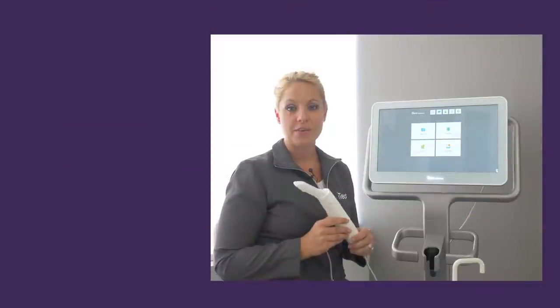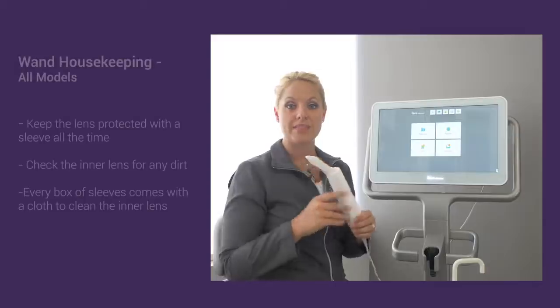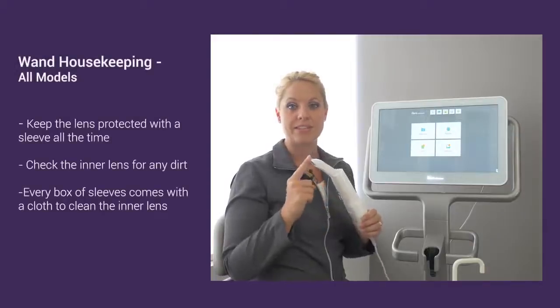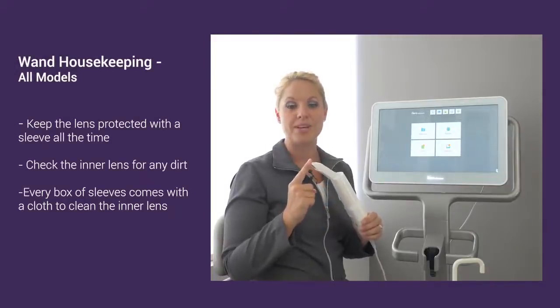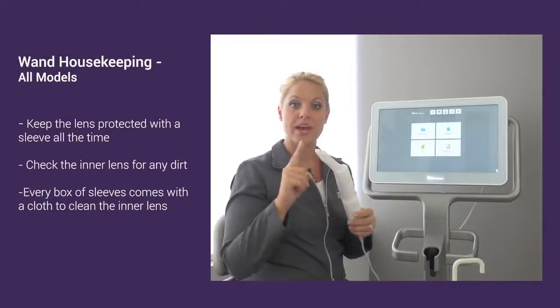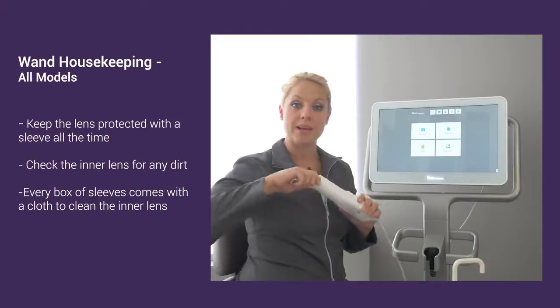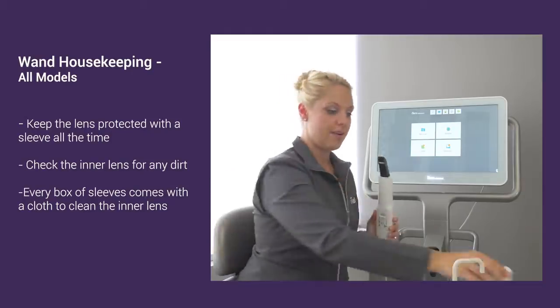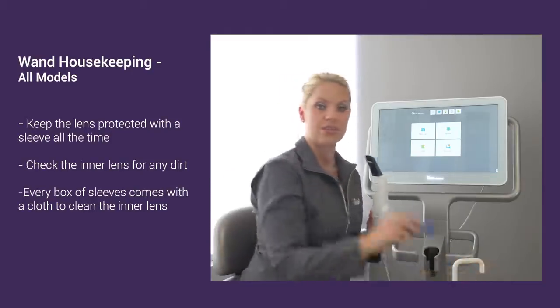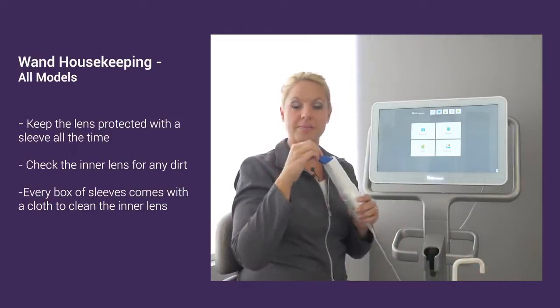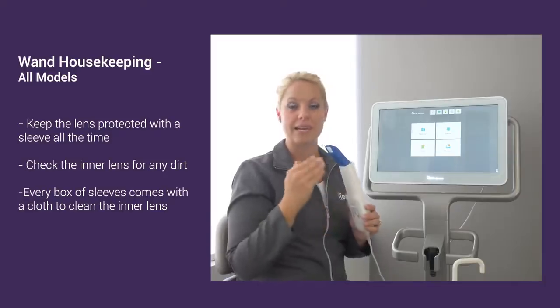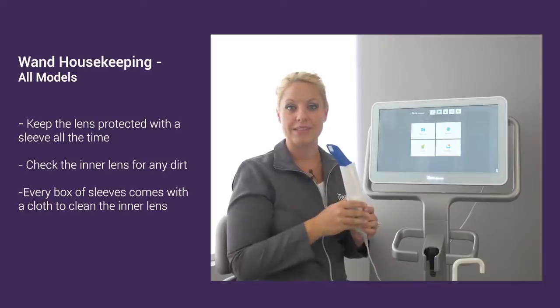For care of your wand, make sure that we have a sleeve on your wand at all times. When we're scanning, we have your white sleeve on. But when we're not scanning, always make sure that your blue protective sleeve is placed on the wand to prevent anything from getting on that inner lens.